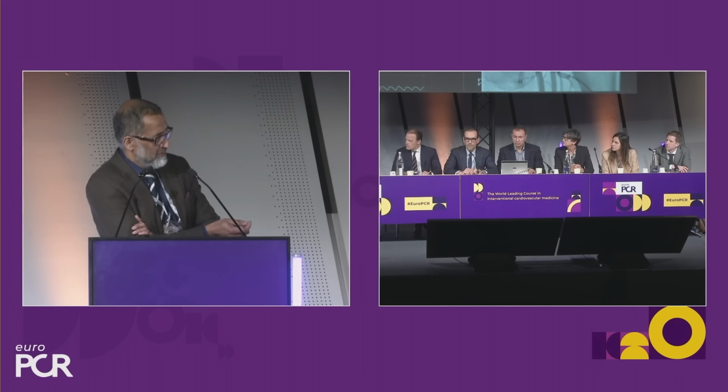So we've got an external pacemaker box with crocodile clips. One wire is from the vein up into the right atrium. The other wire is a Safari wire. So the simple metric is the red clip to the right atrium, red to right, and the black clip is on the Safari wire. We've tested the pacing, and we know that we can pace with the amps turned up at 180, very stable, no loss of capture.